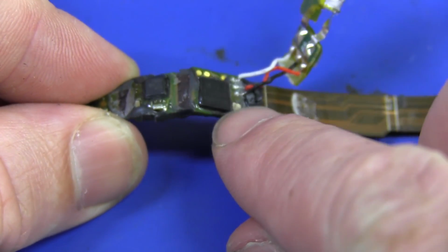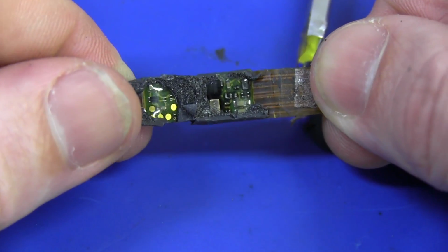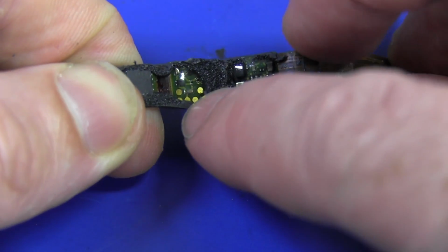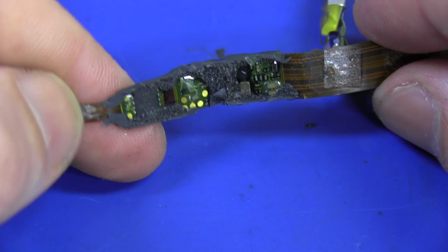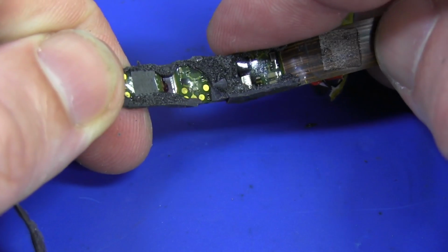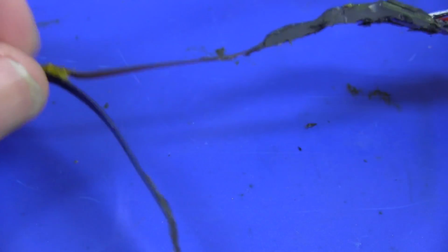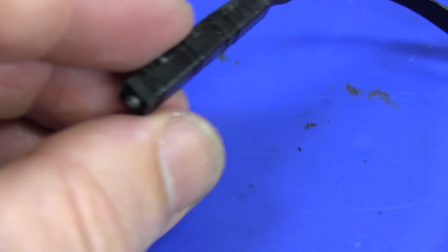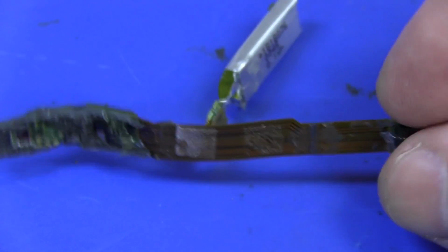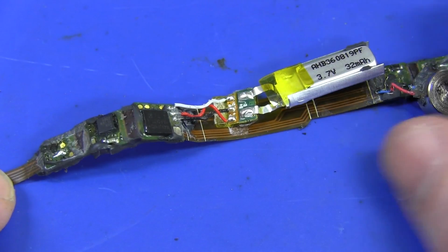And then we've got our main processor board here with the MSP 430 processor. Once again, that's double-sided load, so that'll have some voltage regulation and other support stuff on it. Looks like we've got some test pads there for production testing. And then, yeah, we've got another couple of chips around there, which we'll have to have a look at. That one and that one down in there with the test pads, and then that goes all the way down to that programming / test tactile switch interface. They've put a lot of effort into this thing to design and manufacture this thing.